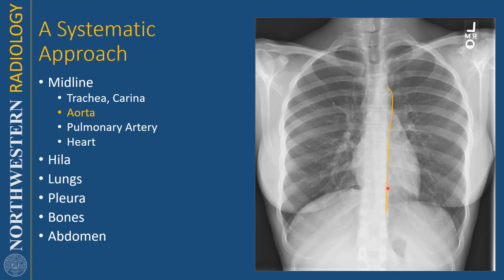I look at the aortic arch and the aortic descent, making sure I can see it all the way down. Then I move to the pulmonary artery, making sure that it's not enlarged. I look at the AP window — that space between the aorta and pulmonary artery — making sure there are no enlarged lymph nodes there.